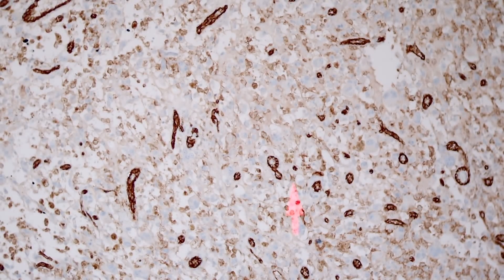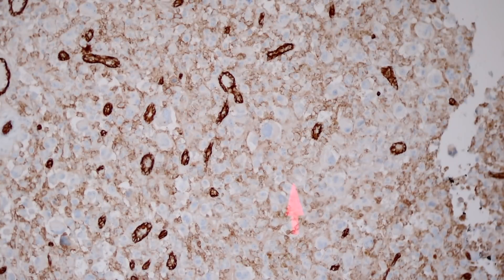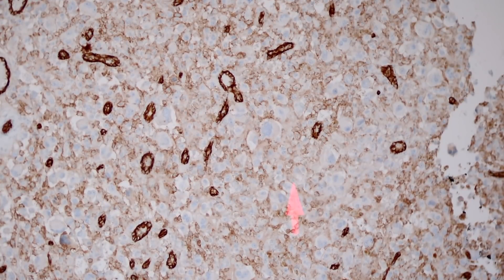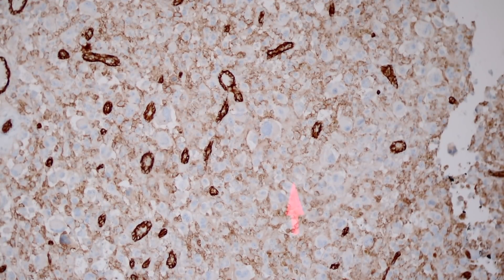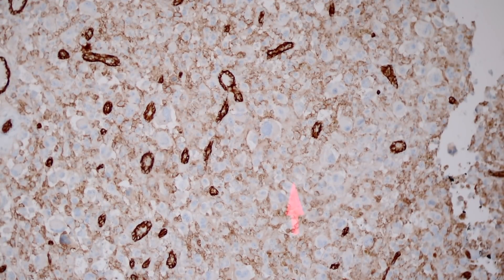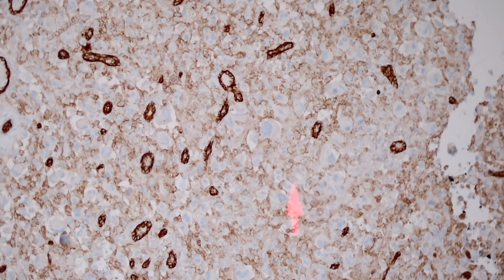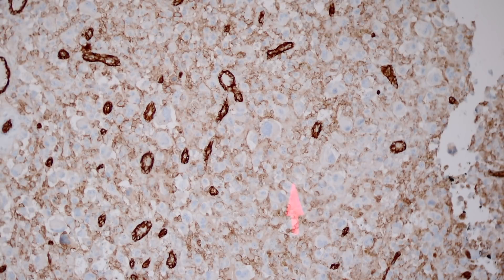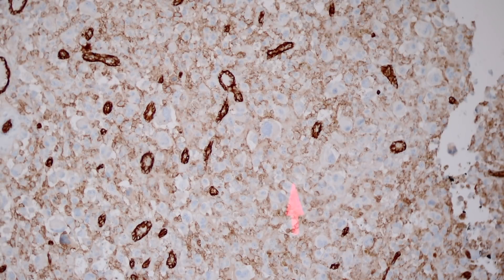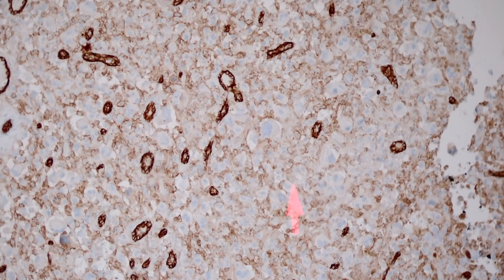If you're really struggling — if your CD31 is very blushy and making you uncomfortable — then add on an ERG or CD34, or other vascular markers. But the important thing is to not overcall something like this as angiosarcoma.